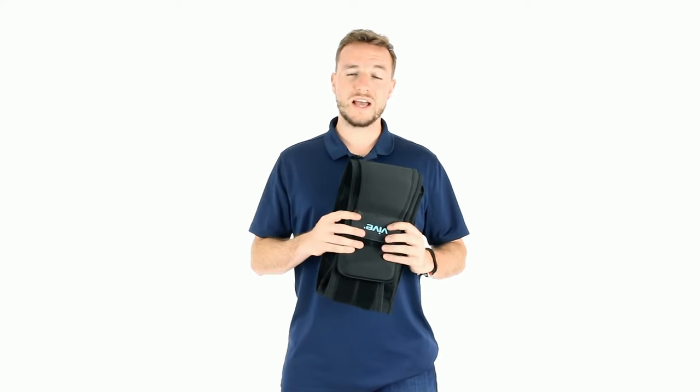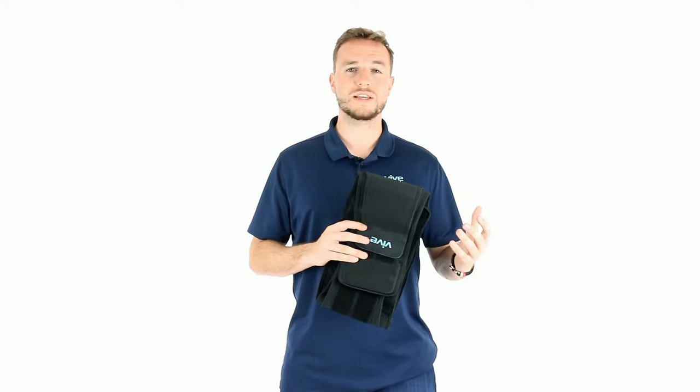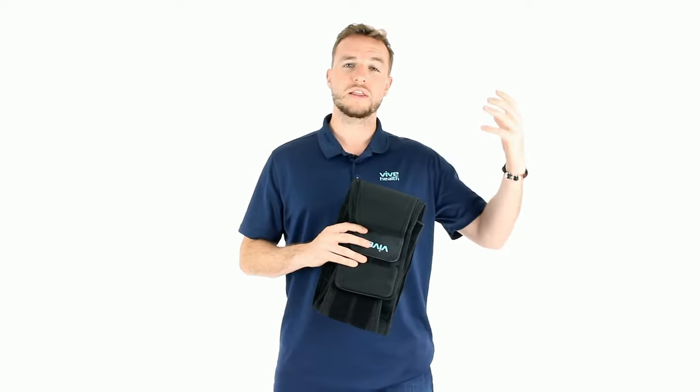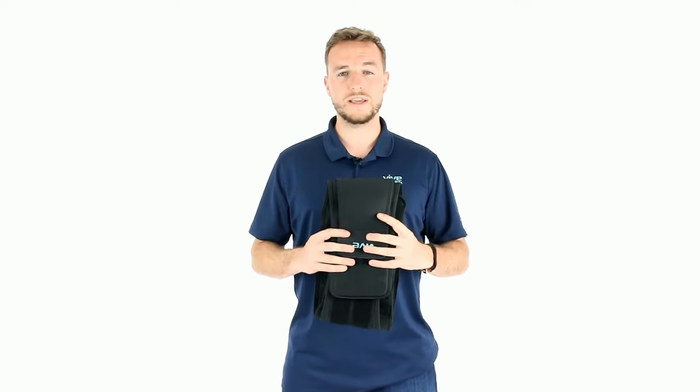This back brace comes in two different sizes. It comes in a one-size-fits-most, which covers any waistline from 26 to 44 inches, and then we have an extra large size that goes from 44 to 64 inch waist.